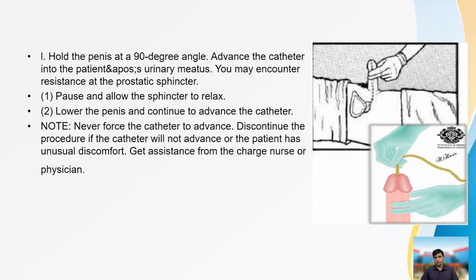Pause, allow the sphincter to relax. Next, lower the penis and continue to advance the catheter. Note, when inserting the catheter, we must never force the catheter to advance.